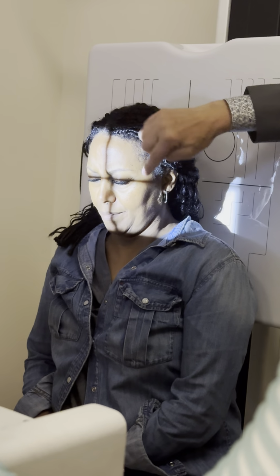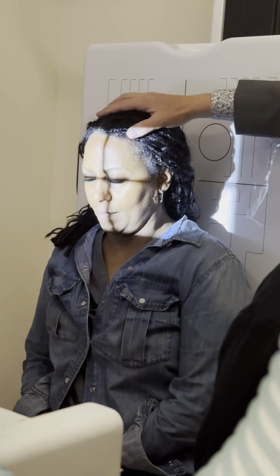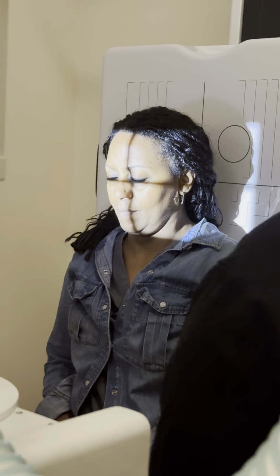Because then when I did outer canthus, it's going straight through her ear hole. This is the infraorbital. That's the orbital meatal. If we're a little off on this, that's how you fail a practical. That's why we're spending so much time talking about the 7-degree difference between orbital meatal and infraorbital. The mistake you will make on this exam is you won't pay attention to the detail.